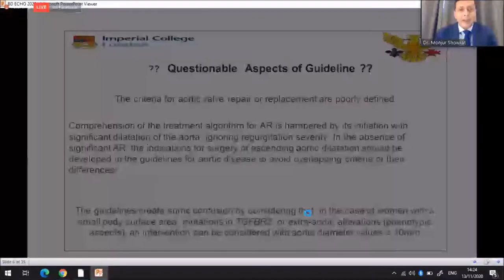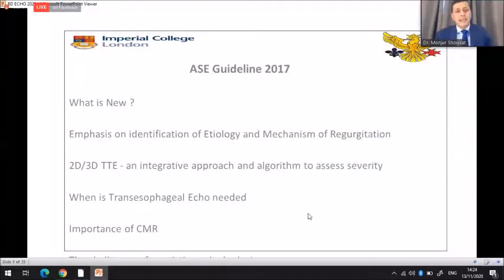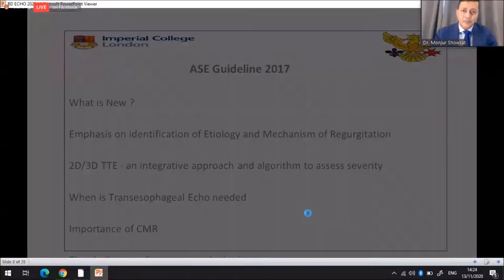Update with new guideline. So let's talk about the American Society of Echo guideline. And if you see, the American Society guideline was also published back in 2017. What is new there? They have emphasis on etiology and mechanism of aortic regurgitation. During my talk, I'll briefly talk about a couple of slides on the mechanism of aortic regurgitation. It also has an integrated approach of 2D and 3D transthoracic echo and also transesophageal echo where it's needed. And that guideline also emphasizes CMR.